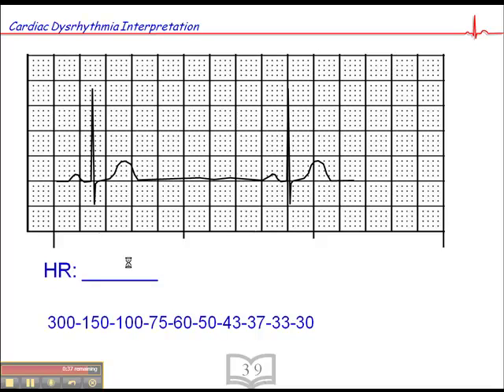And lastly, this one — we have the QRS that falls on a dark line, so we'll count forward: 300, 150, 100, 75, 60, 50, 43, 37. Between 43 and 37, we'll say the heart rate is approximately 40.